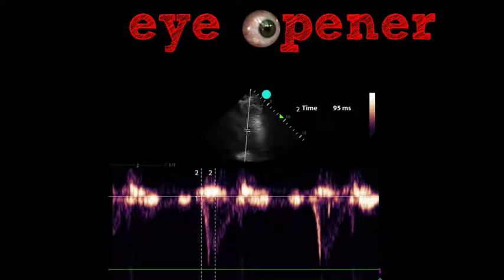So this guy would have met the 60-60 rule with his tricuspid regurgitation pressure gradient, because that was less than 60, but he did not meet the criteria of a pulmonary artery acceleration time being less than 60 milliseconds. So I couldn't hang my hat on the 60-60 sign either, but again, strongly suspicious with a guy who's a few days out from a knee replacement having a pulmonary embolism to be the cause of his hypotension and hypoxia.